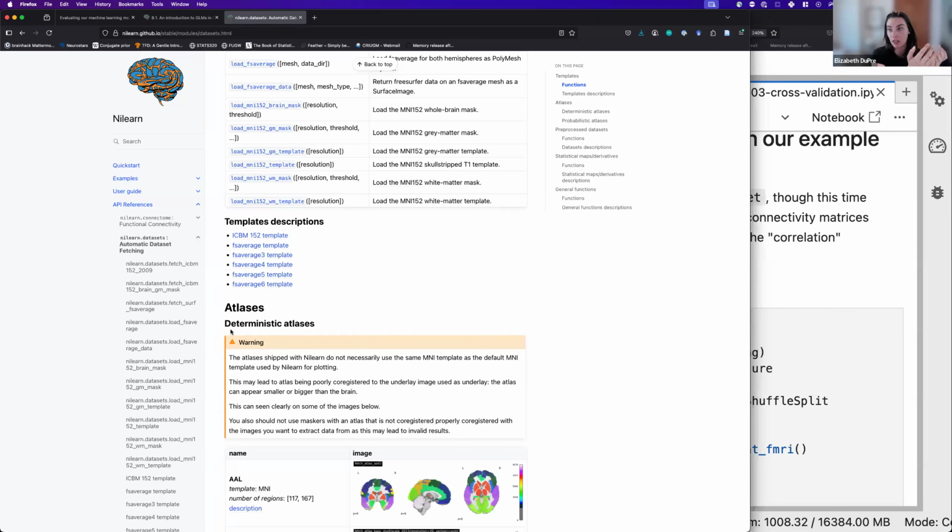What information is it telling you about your data set uniquely that a pre-existing atlas wouldn't tell you? So long story short, it depends, as all things do. But there's nothing wrong necessarily with either approach. I wouldn't say one is distinctly better than the other.